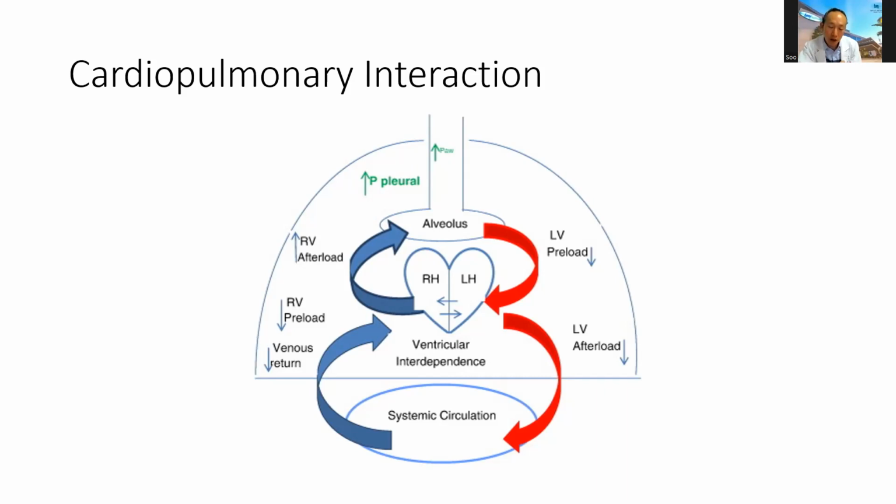Of course, I try not to go into inverse ratio ventilation, whereby I have a longer inspiratory time than expiratory time. It depends on the balance, because sometimes even in your ARDS, if your oxygenation is so poor, you end up with a long I time and a shorter expiratory time just to be able to gain enough oxygenation.